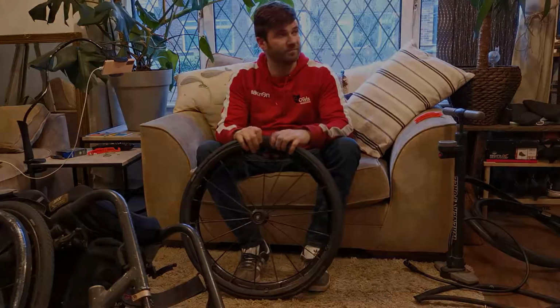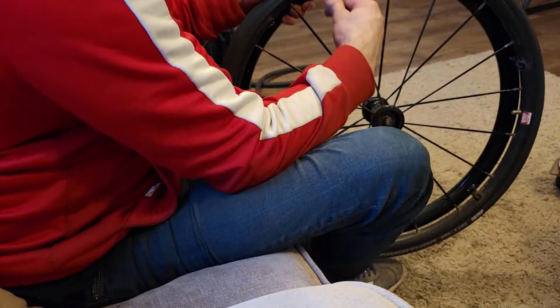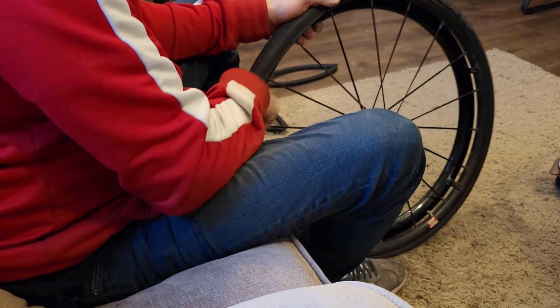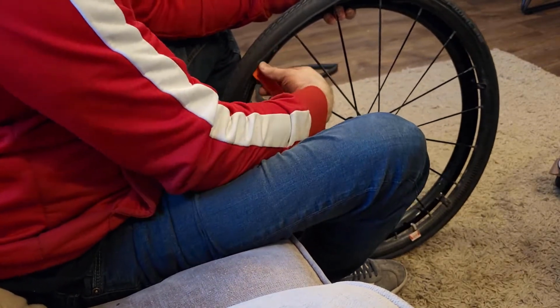Now you're not going to get all of the bead in, but you should be able to get it to around about 12 inches left, and then using your tyre levers and holding the rim in place with one hand, you're able to just work the tyre levers in and get that bead back into the rim. Sorry about the angle here. I didn't have the camera quite pointing at the right part of the wheel, but you can kind of see what I'm doing. I'm using one hand to hold the bead onto the rim, and then using the tyre lever to inch it forwards, probably about 2 or 3 inches at a time, and just slipping that bead over the rim.